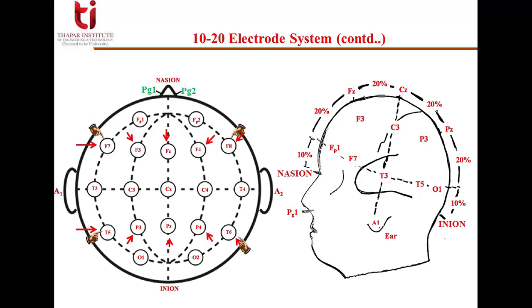So this was all about the 10-20 electrode system, which is used for measuring and placing electrodes at accurate positions on the skull surface. The oscillations are produced, as we have discussed, with different frequency and shape for the EEG electrodes. The oscillations that can be measured with EEG are even visible in raw, unfiltered, unprocessed data. However, the signal is always a mixture of base frequencies, which are considered to reflect certain cognitive, affective, or attentional states. When the brain is in a certain state, the frequency patterns may change.